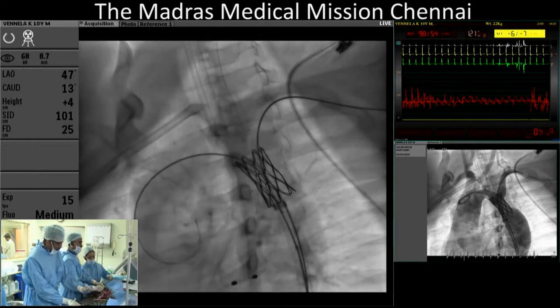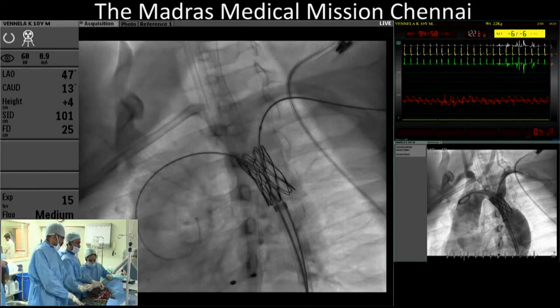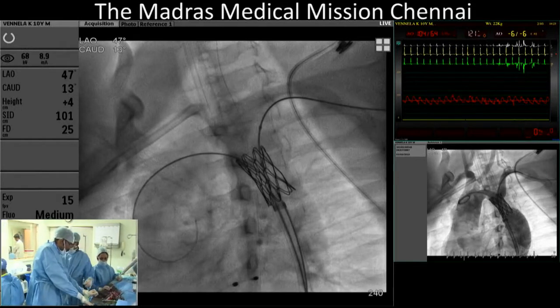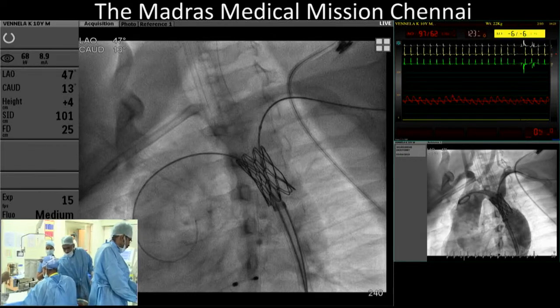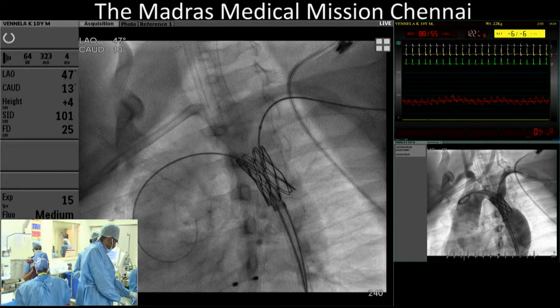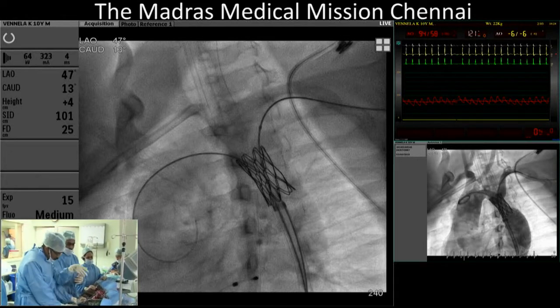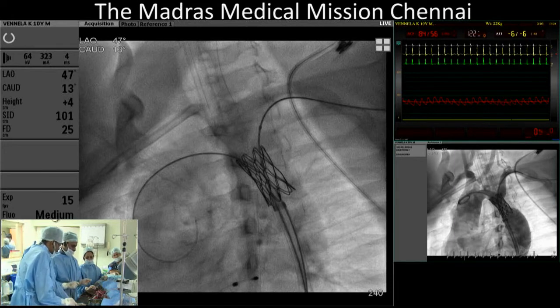Well, the other option is to go for surgery, but not to the arch, but to an additional bypass, ascending, descending, and then you have a double orifice. Oh, yeah. A very easy operation, that is. Yeah, brilliant. No, that is an easy operation. No, it's not. It is. If it was, the surgeons would be happy to do it all the time in this anatomy. They're not happy to do it all the time.